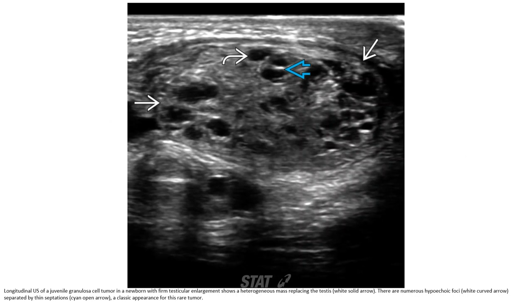This ultrasound shows a juvenile granulosa cell tumor in a newborn with firm testicular enlargement. There is a heterogeneous mass replacing the testis, with numerous hypoechoic areas separated by septa — a classic appearance of this tumor type.